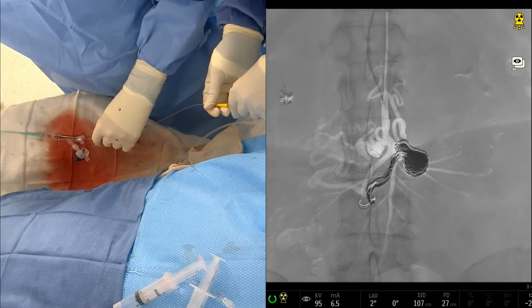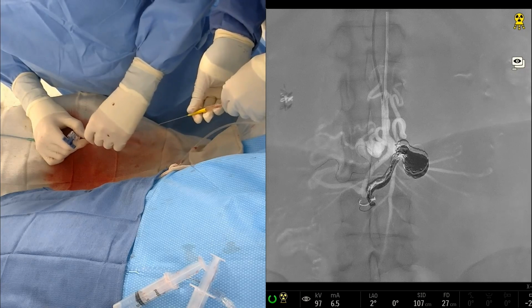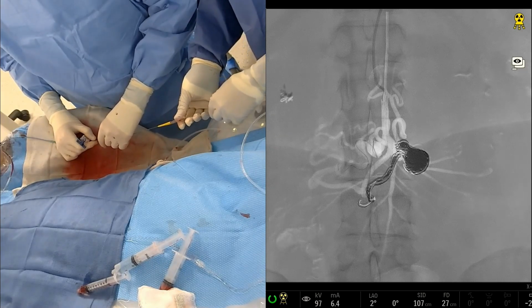I would imagine in that situation, the coil packing density is much more relevant than it would be in a case where you can do both the inflow and the outflow. There we go. A little bit of work there, but great. I think that's all we need, right?